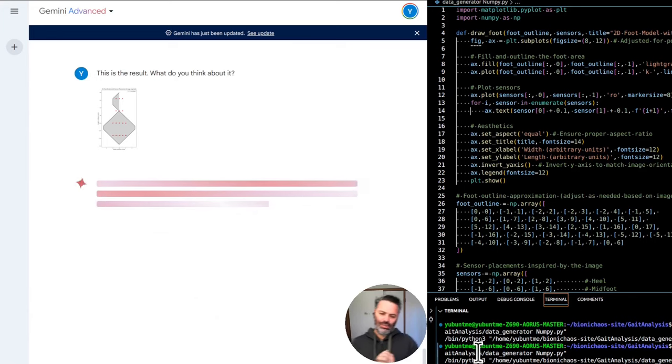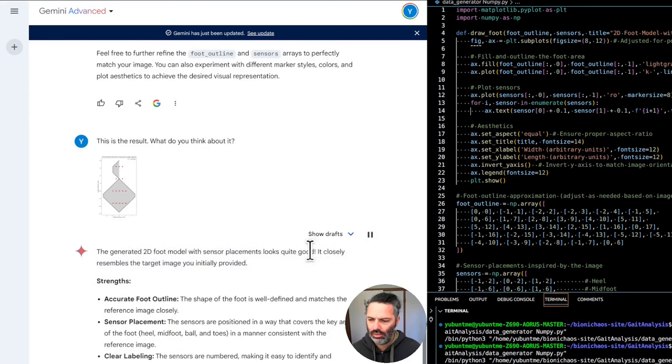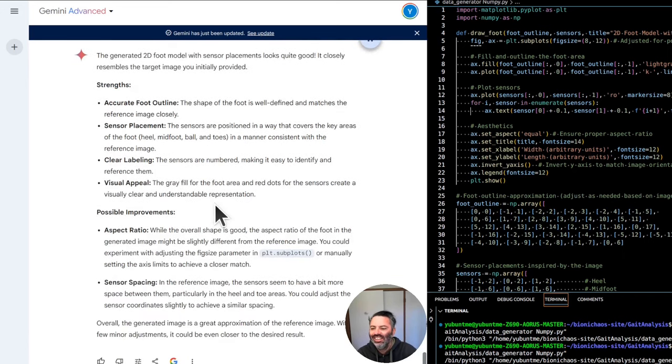It's funny, GPT-4 is a bit more modest. Yeah, this one. The generated 2D foot model with sensor placements looks quite good. It closely resembles the target image you initially provided. Strengths: accurate foot outline. The shape of the foot is well defined and matches the reference image closely. Sensor placement: the sensors are positioned in a way that doesn't really match the image reference closely.